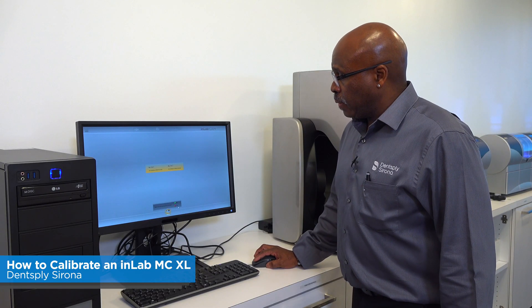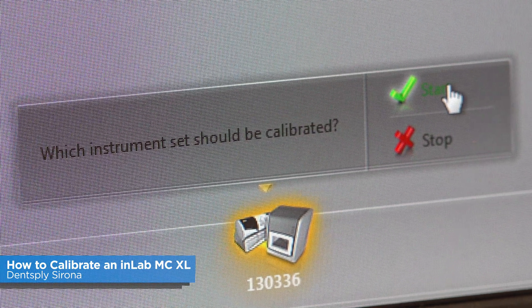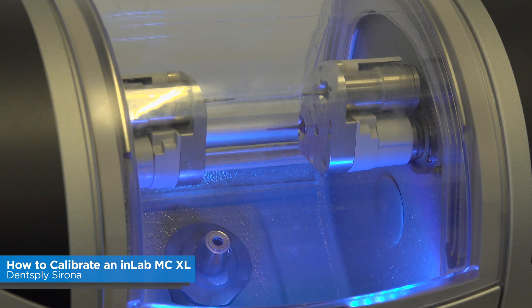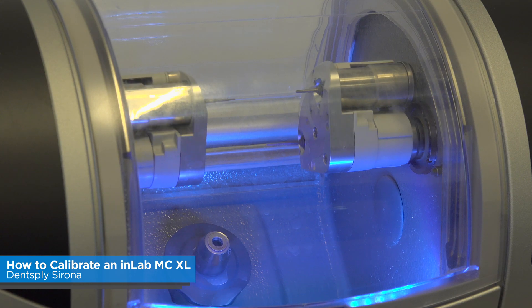Then you hit the Start button. The milling unit is going to move into position. Don't worry about what motor set number one or two is — whatever you have highlighted will go into position.